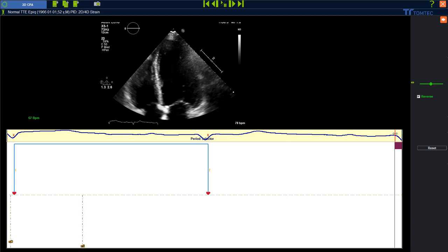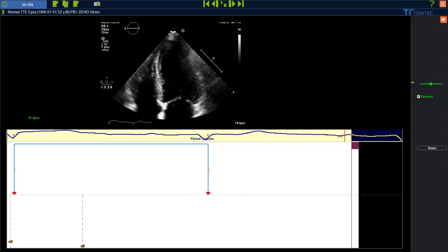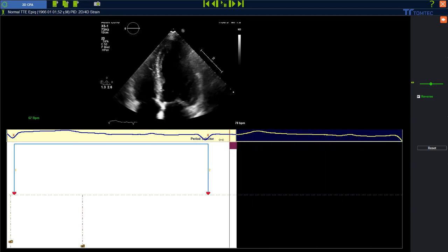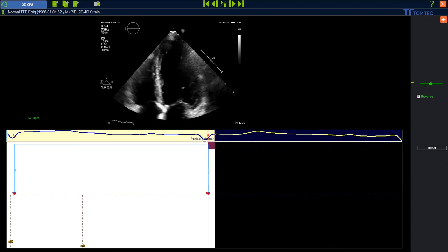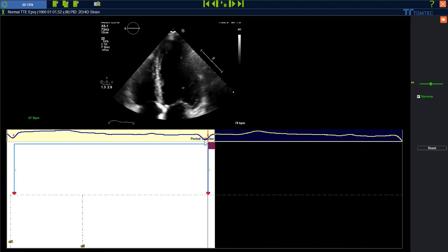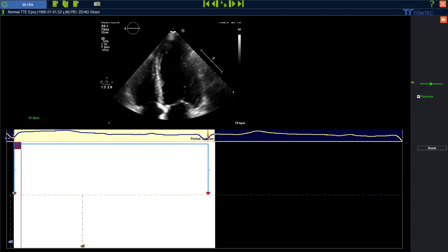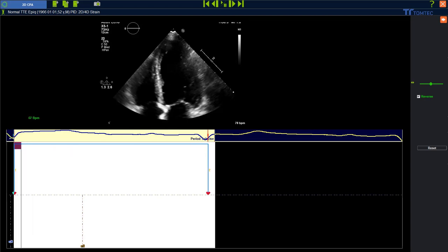We can see that the red X, like before, is missing at the end. Use the red vertical reference markers in the period selector and drag and drop the red markers to select the desired cardiac cycle. It's also possible to exclude the first beat — drag and drop the red markers on the left side for that.